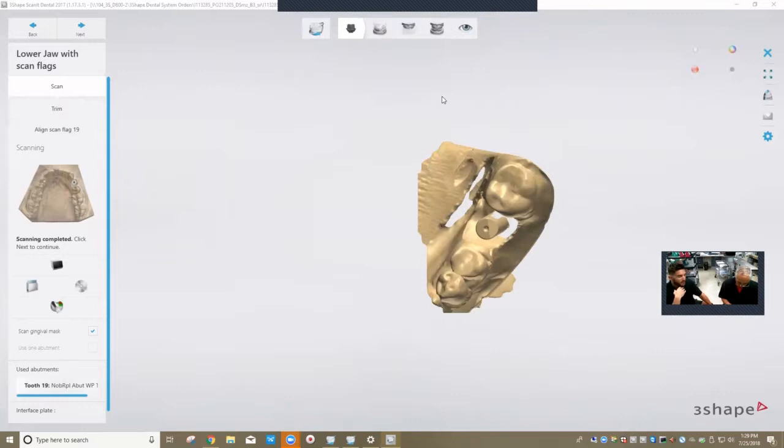And place the soft tissue back into the model. And this is where you're going to want to apply scan spray, because the soft tissue material that we use is more lifelike and accurate, but it is a little shiny, so sometimes the light will reflect off the tissue and you won't get a proper scan. So by applying some scan spray to it, we'll mask it out and you'll get a good scan. You spray about 3 inches away from it, just a thin layer of opaque spray.